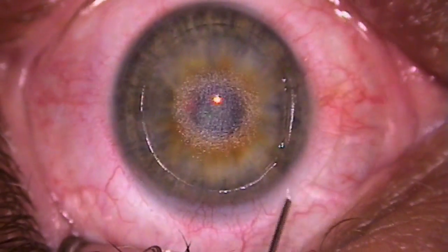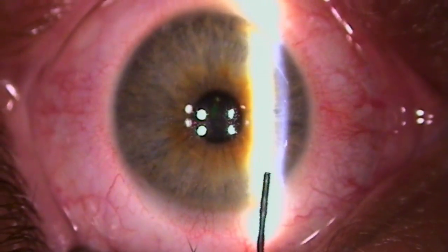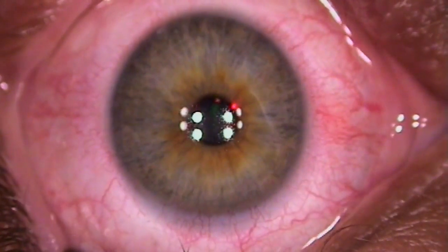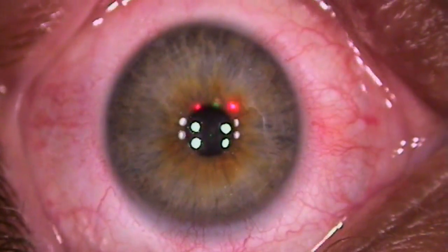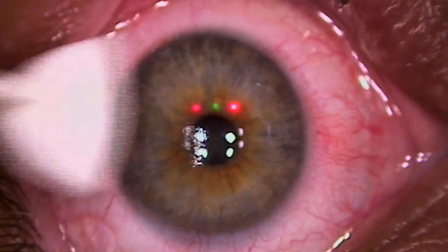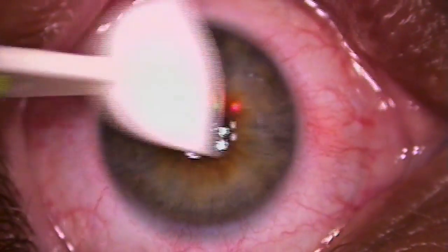I'm going to show you that green light again. You're going to notice when you get up from here things are a little cloudy, but better — and then tomorrow morning they're way better. So be patient, let the good stuff happen. I'm going to give you something to help you sleep — I'd like you to sleep for about four hours. The most important thing I'll tell you today is to remind you not to touch anything. Don't even touch your face today. If you don't get near your face, you can't get near your eyes — so stay away from your face. Slim goggles so you don't inadvertently rub your eyes.